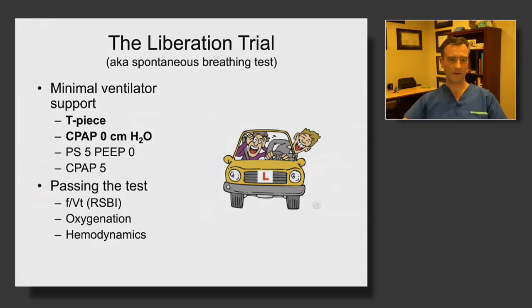Does their CO2 go up? Do they become distressed? Does their level of consciousness go down? These are all the kinds of things that you look for to see that a patient's breathing comfortably and spontaneously during the spontaneous breathing trial.